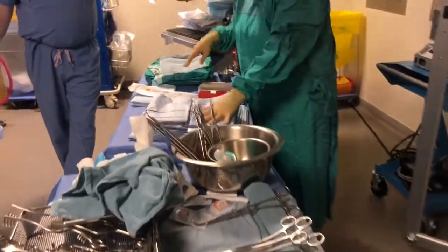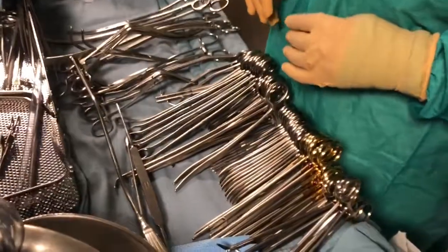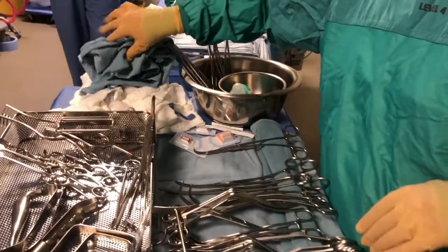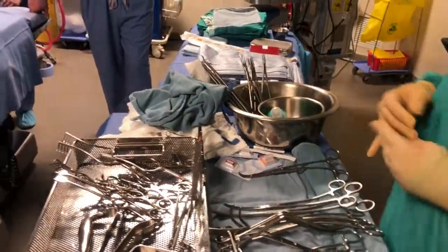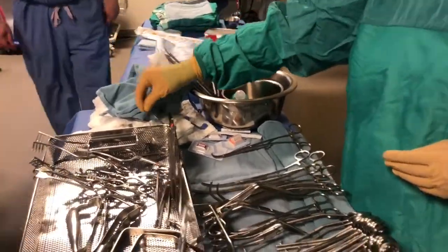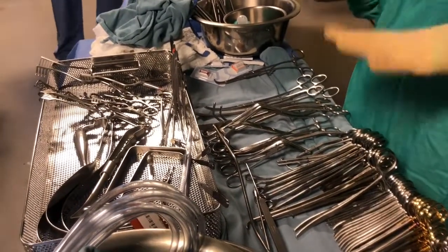I just stepped on the instrument. Did you count those little tiny weird things that hang over the edge, under that blue towel? Is that what you're saying? This one? Yeah. But that's just counted as a retractor? Yeah. Okay. It's a little spring retractor. Right. That's all that is. Okay? So that's how we would count in.